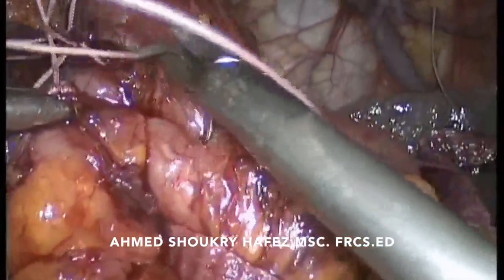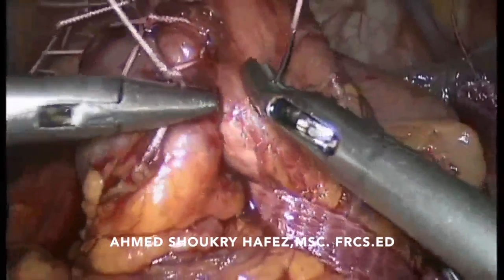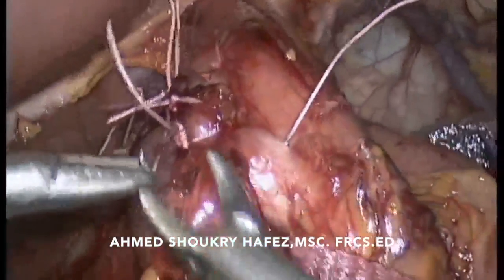You must be very careful in this stitch not to incorporate the tape as you go closer to the gastroesophageal junction.